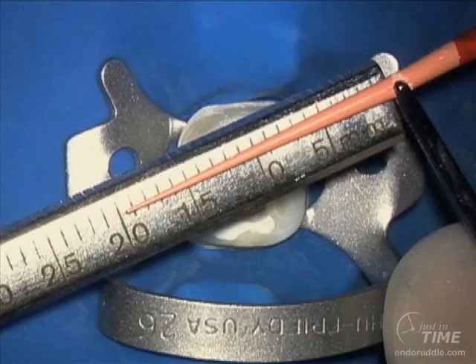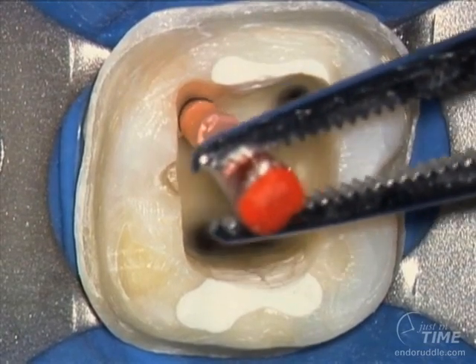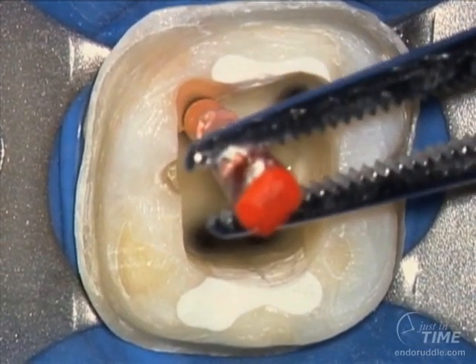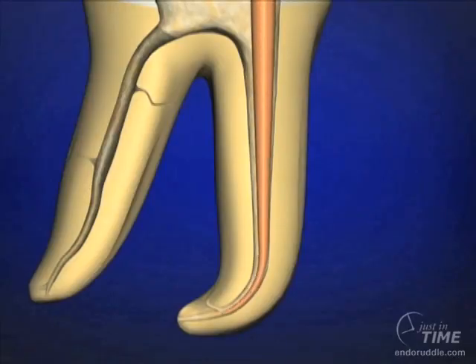In this instance, we fit a master cone — a non-standardized medium master cone matching the ProTaper Finisher 2, which is a 2508. The tip diameter on this cone is 25 hundredths. The cone is fit in a wet canal and gently teased and slid to place. We lift it up and reseat it repeatedly, marking our tugback point.